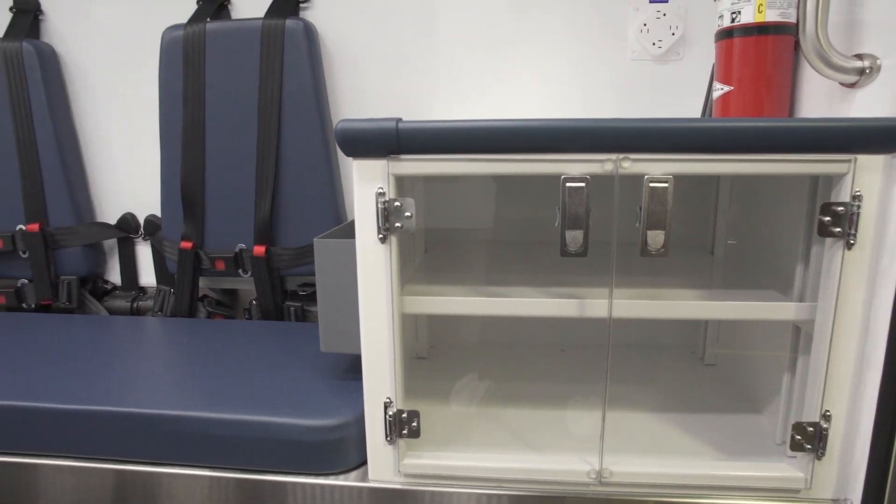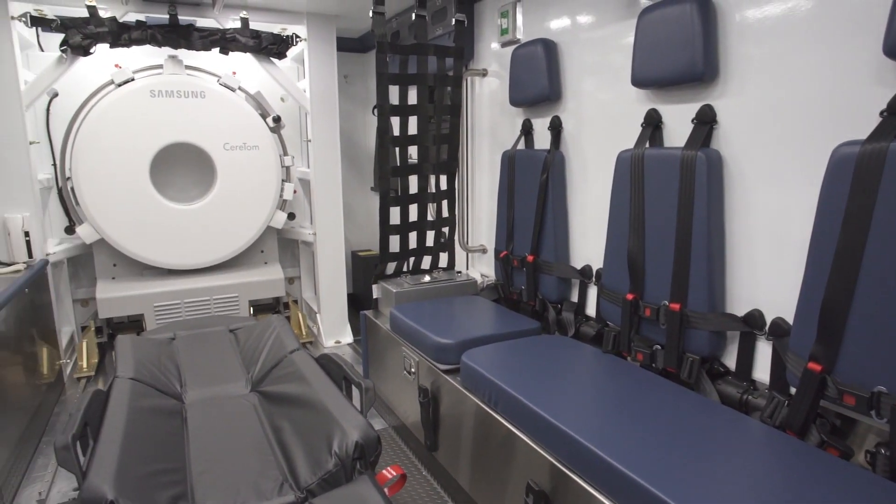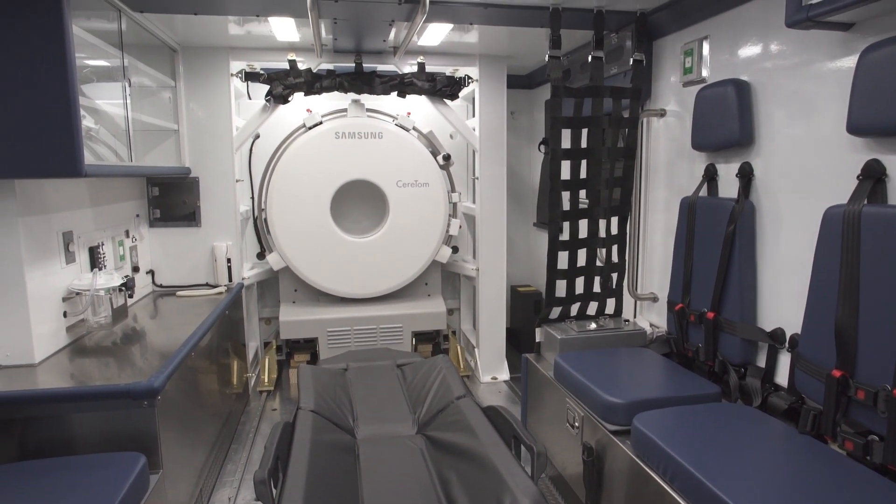The standard also requires an equivalent of 26 g-force in the side-to-side or lateral direction. Looking at those forces, we realized what a big challenge that is for an almost thousand-pound piece of equipment. If the mobile stroke unit is in an accident with forces that high, the scanner, which is designed for hospital use, may not stand up to the forces being exerted on it.